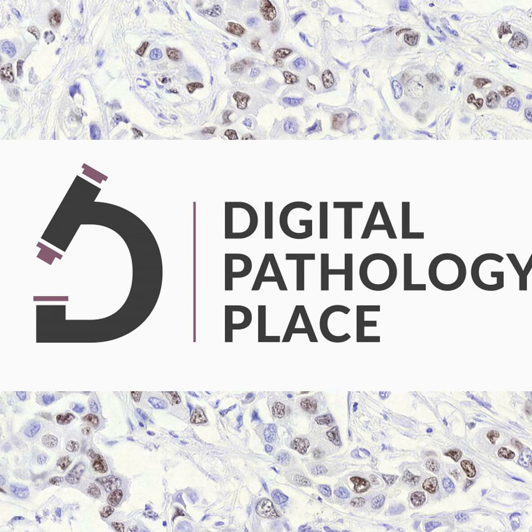So the bottlenecks are changing as well. It's becoming access to data. It's becoming training of networks. It's becoming compatibility with new imaging devices. And I would say the ability to support the analysis of new and increasingly complex data sets. And of course, it goes without saying, connectivity with existing digital infrastructure and workflows. And certainly as computational pathology is beginning to make its way into routine diagnostics, we are seeing that regulatory requirements are something that will demand a lot of attention and investments if you want to make a difference in diagnostics.